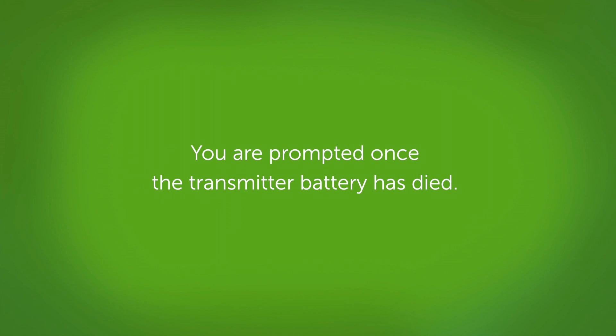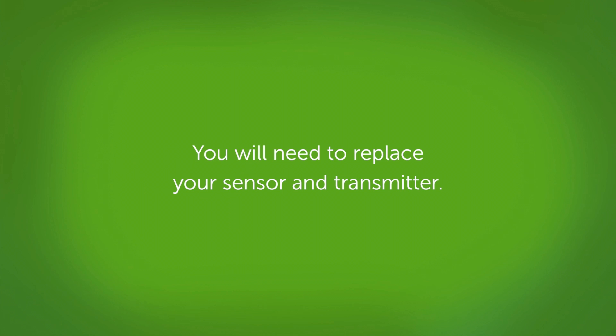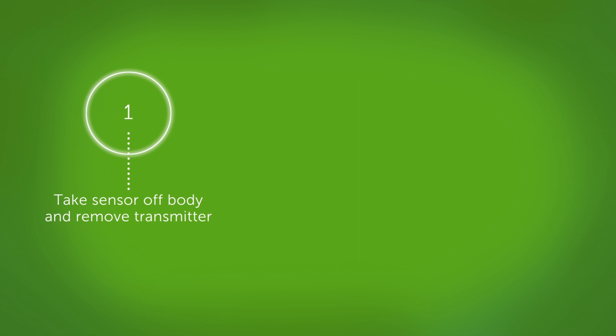You are prompted once the transmitter battery has died. At this point, you will need to replace your sensor and transmitter. To replace your Dexcom G6 transmitter, follow these steps. First, take the sensor off your body, then remove the transmitter from the holder.